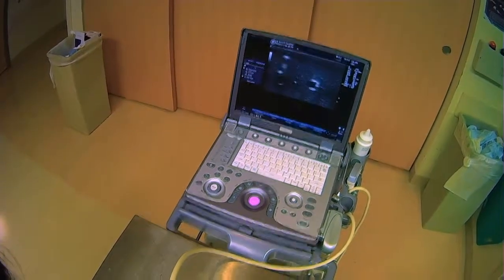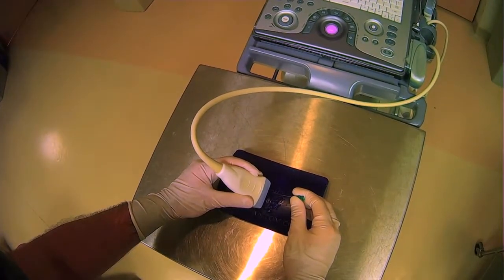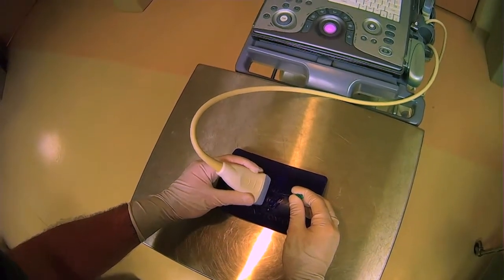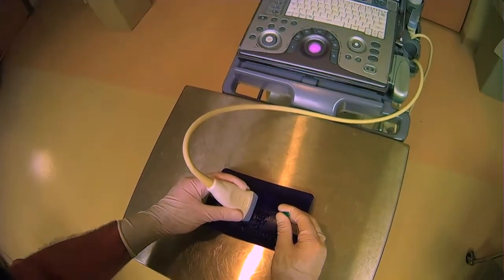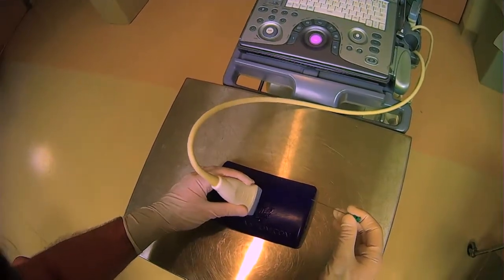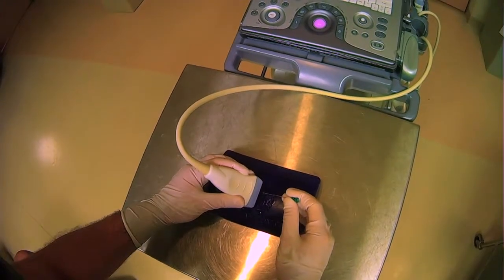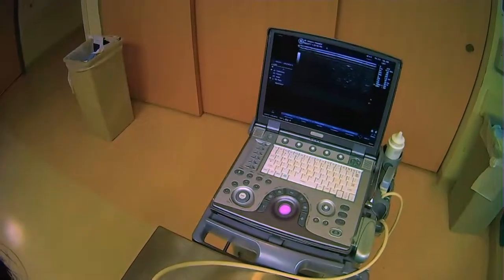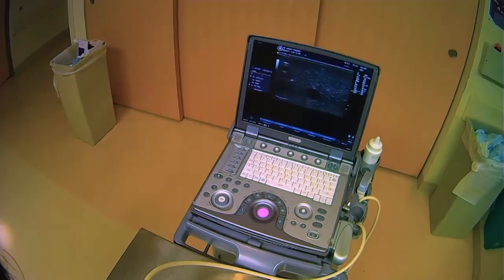So this takes a little bit more coordination because as your right hand is bringing the needle deeper you have to be shifting the way you're holding the probe like this to follow the needle along. But I think that it can be very useful to appreciate that when you oblique your probe like this, once you insert the needle you can immediately start to see it.